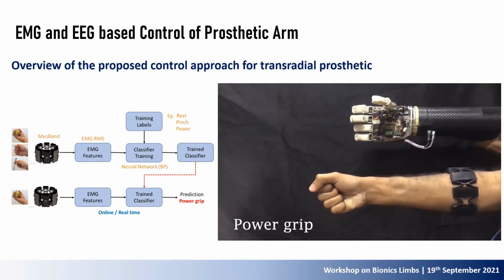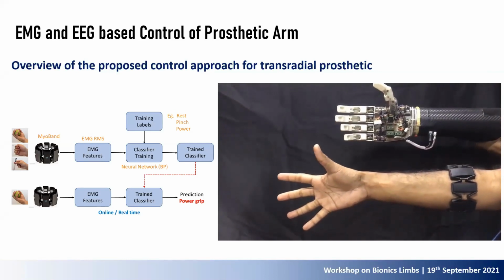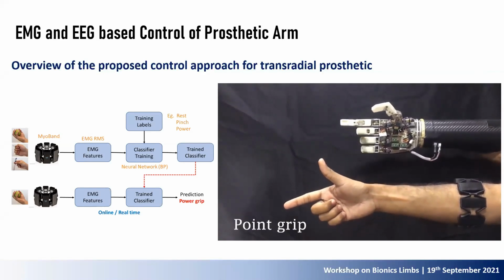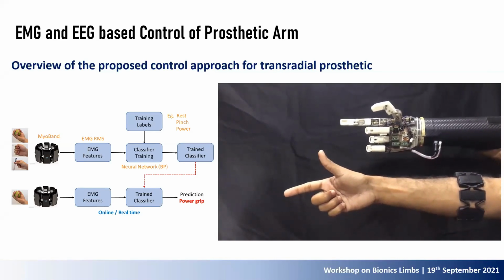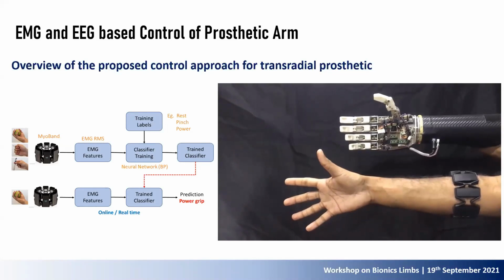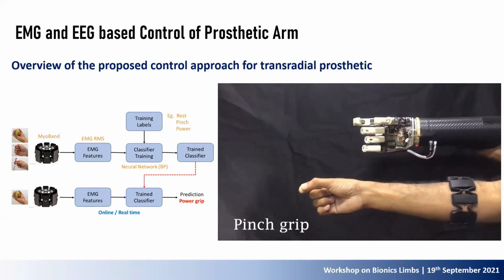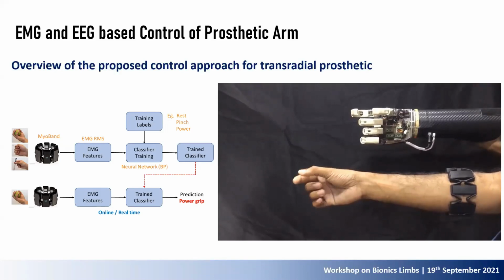I remember I saw one question in the previous session that someone asked, where do you place your EMG sensors for detecting these movements, for example. Basically, you can place your sensor on your forearm to get those related muscles. Yeah, so I'll quickly go to the next slide.